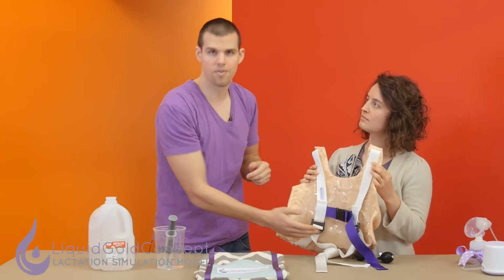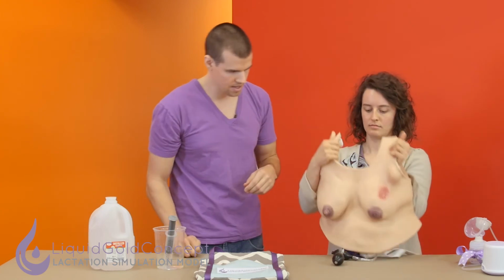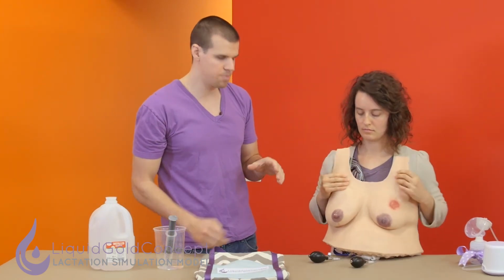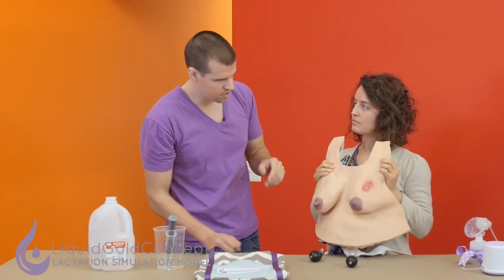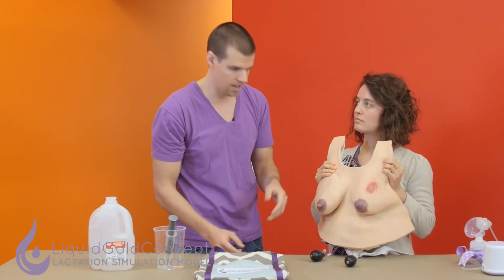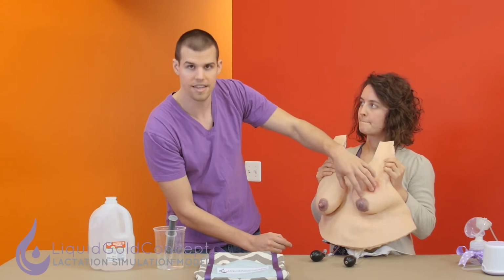So now the reservoir is full, and we can now begin priming the sim model. You might not always have to prime the LSM, but if it's been sitting for a couple weeks, this might be something you need to do. So to prime, what we want to do is get water into the lactation circuit. The lactation circuits sit deep in the breast tissue behind the nipple.